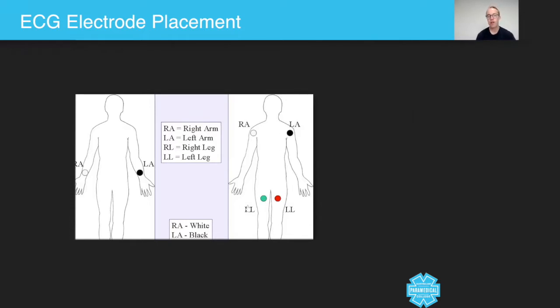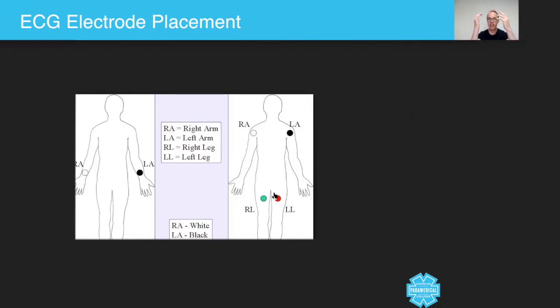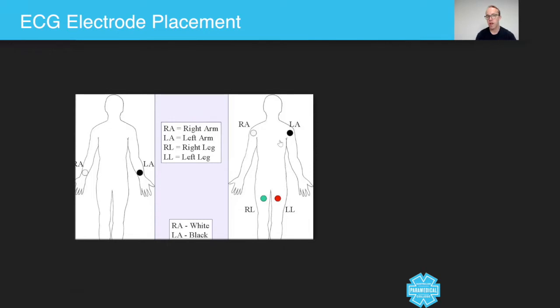Now the benefit of doing it on the body, and this is one of my preferred options, is that it reduces the amount of movement. Think about the hands. They're particularly movable. Therefore it interferes with the reading. And of course you can get just as good quality reading in terms of distance.